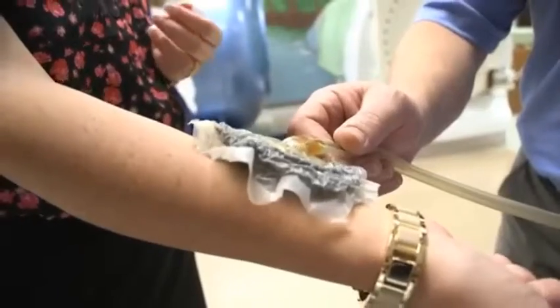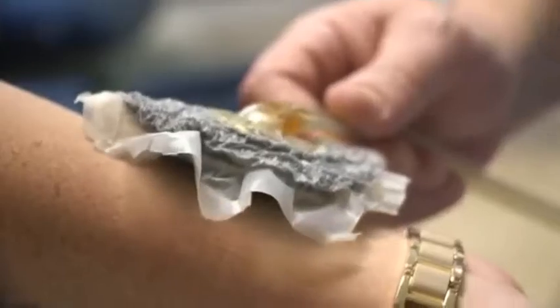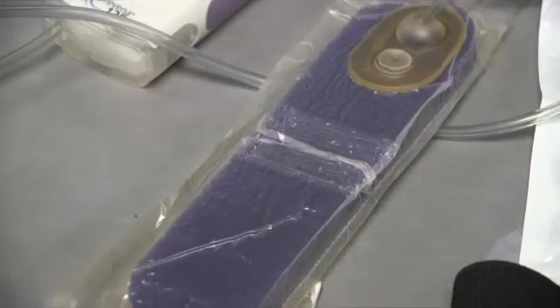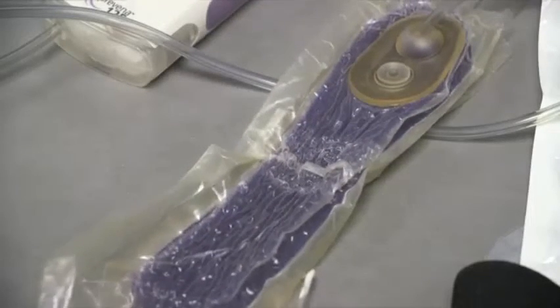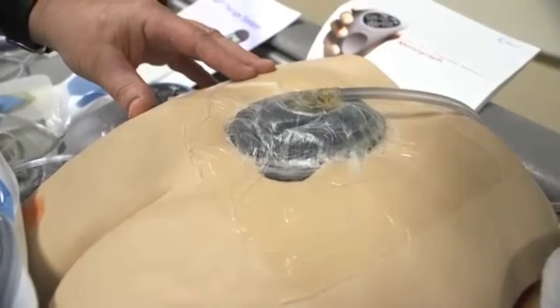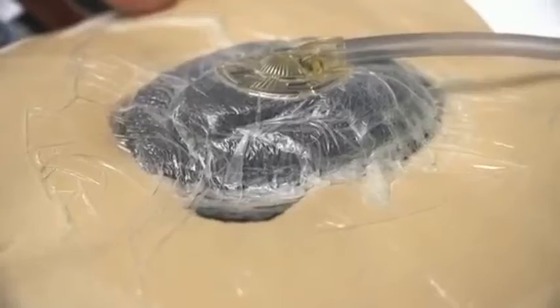It works much like a vacuum seal. After foam is placed inside the wound, a vacuum-assisted closure is placed on top. Once the machine is turned on, in seconds the wound is slowly being pulled together. The machine continues working throughout the day. Negative wound pressure therapy is used on wounds that are too large or too deep for stitches or staples.